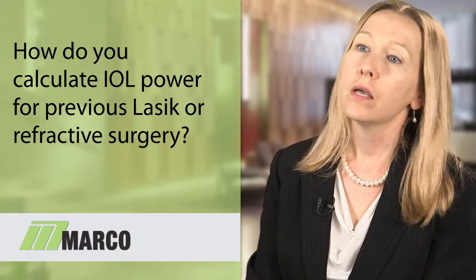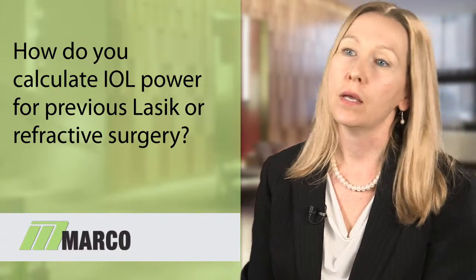So this is where I found the OPD truly fascinating. As we all know, we can use different methods to calculate IOL power after refractive surgery. All of these methods have been proven to be less than ideal, and the fact that we still don't have a perfect method just shows that we do not have a great way of calculating that central corneal power for post-refractive patients.